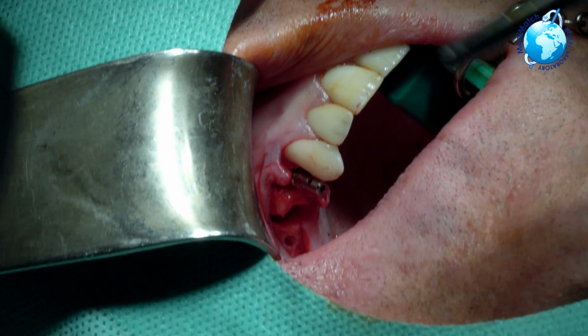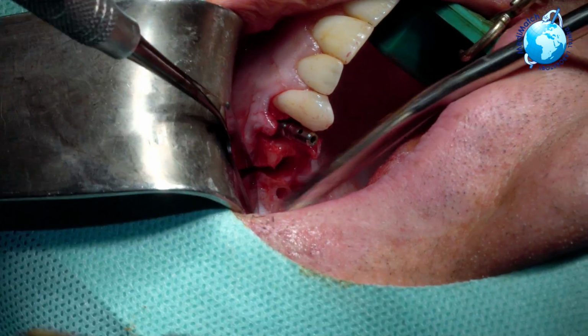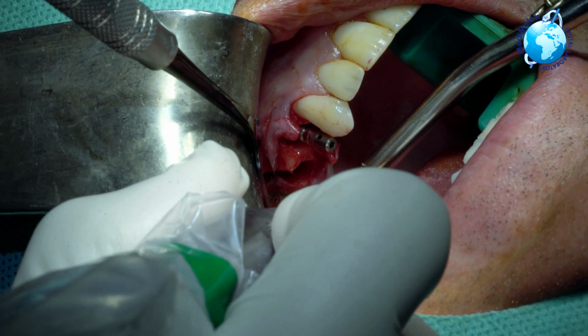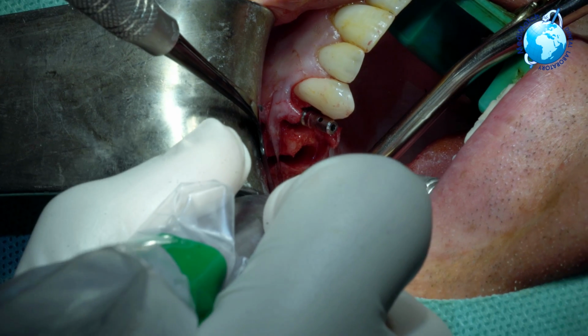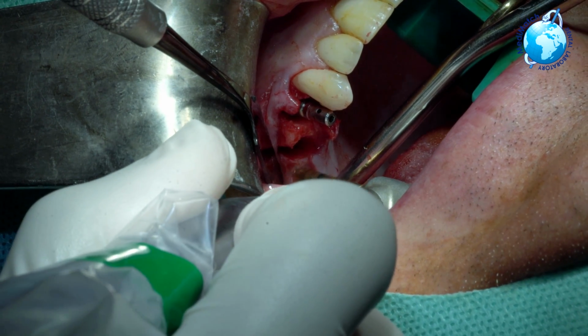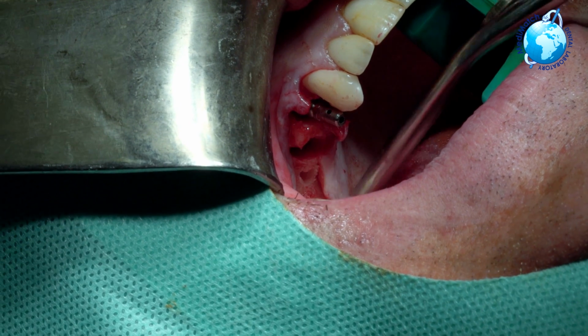Okay, we're going to go first marking at 7. So I'm just going to widen that osteotomy bit. How are we doing, Alan? Okay, second drill. Open a little bit wider, Alan. A little bit wider. So again, we've got drill access issues, so I'm going to come in sideways and then correct. Down to there. Perfect.